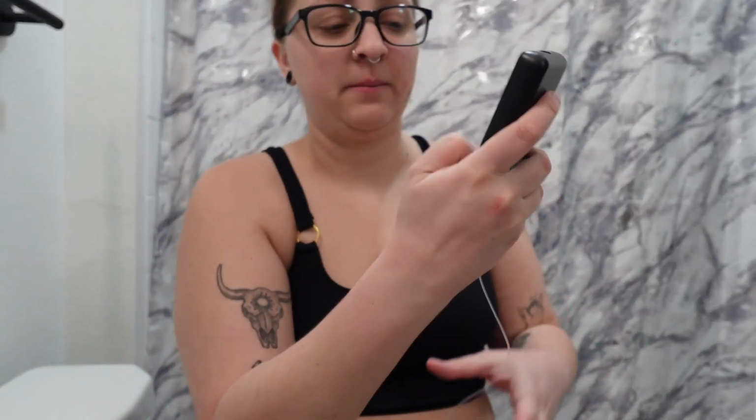So I'm gonna go in here and change cartridge and tubing. I'm gonna go ahead and let it rewind. I feel like doing it in the bathroom is unsanitary, but also sanitary at the same time, and people that get it, get it. Maybe it's just me that I'm like, this doesn't feel sanitary, but at the same time, I just cleaned my bathroom, so I'm hoping it's fine.